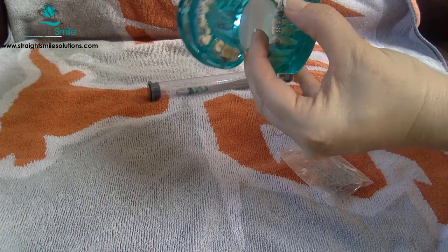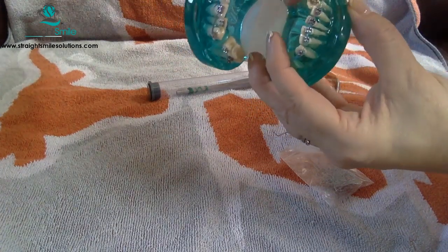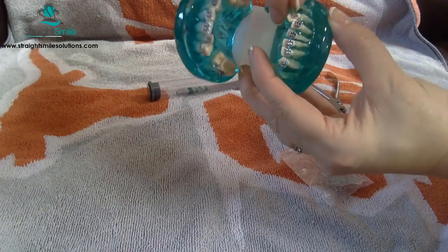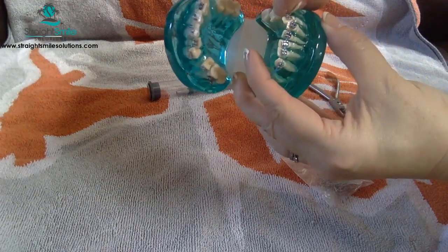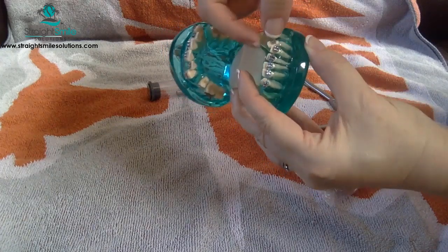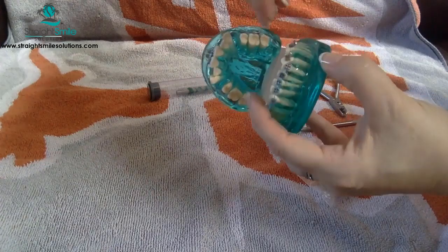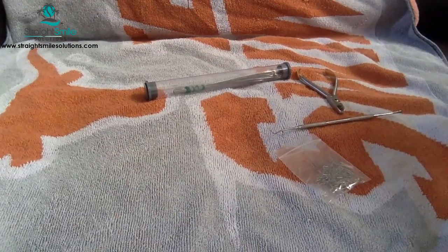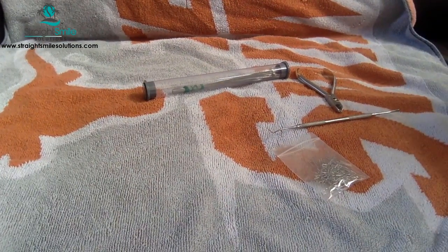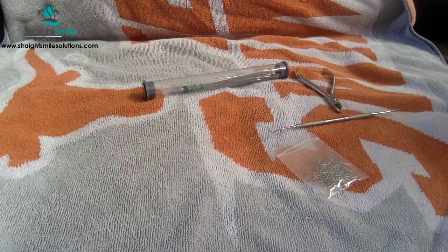I'm going to make sure I get around all the wings. See, I did it. Oops, except it's not in the slot. Is it in the slot? Nope. Again, I do this much better when I'm sitting in a dental chair. So, okay, get that in there. The main thing is to have it grip all four wings. You've got to grab all four wings.